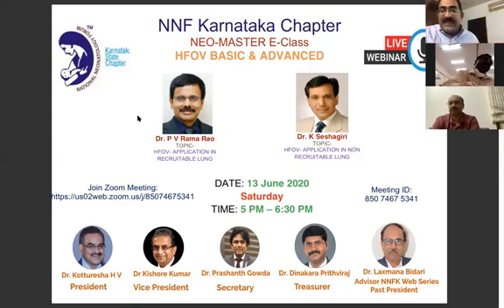that is when you slowly start increasing your frequency, depending on the value of your CO2. If it is really low, yes, you can do quick successions of your frequency, from 5 to 6 to 7. I usually go up to even 12 or even 14 before I extubate.